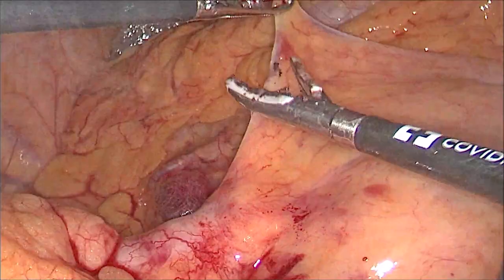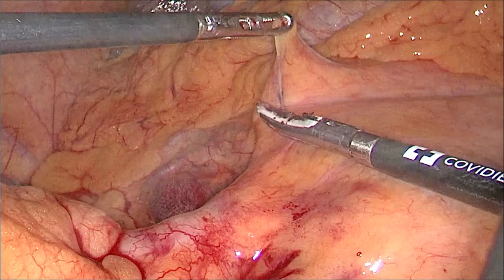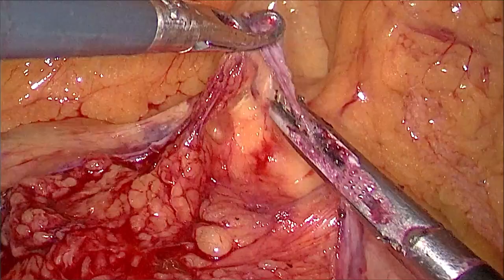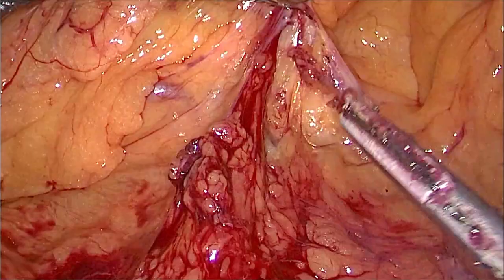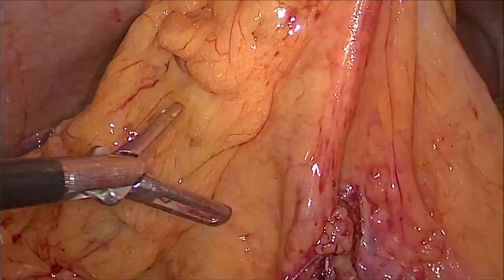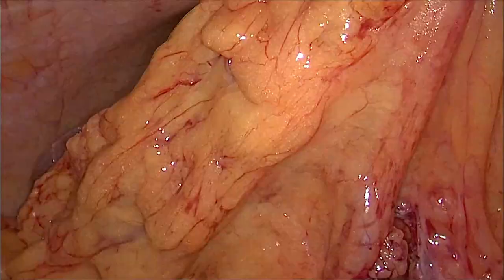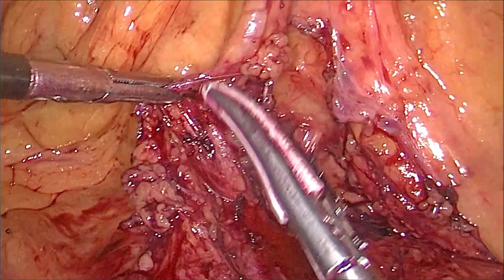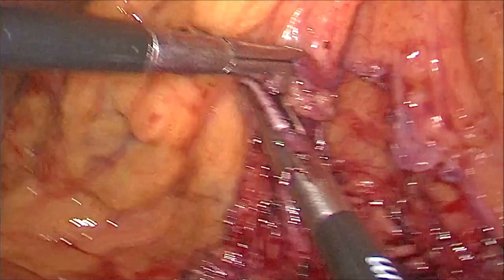The right colon is then put down and we come again from the lower border of the duodenum. The peritoneum is cut open so as to reach the SMV. There are two approaches: one can go from the ileocolics to the middle colics, or the other way around. Since we had bulky nodes in the ileocolic region, we decided to come from the middle colic in this patient. When we lift the transverse colon we are able to see the middle colic arteries and the right branch as depicted.